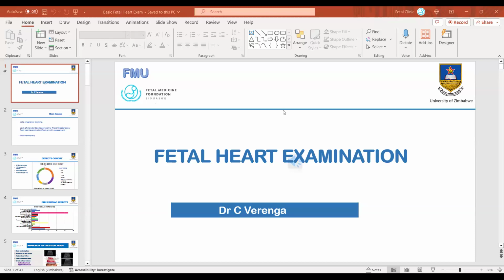So today's talk will be mainly on the fetal heart examination. When we asked people what they would want us to cover, there was a request that we go through the fetal heart examination again. So this is exactly what we are going to do today. We're going to just go through the basics of fetal heart examination.